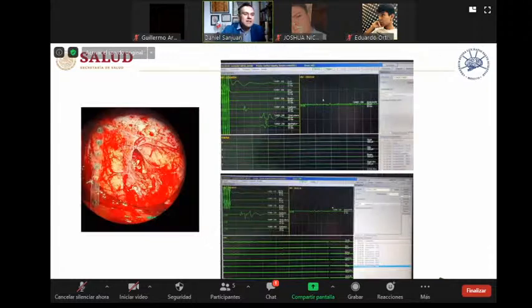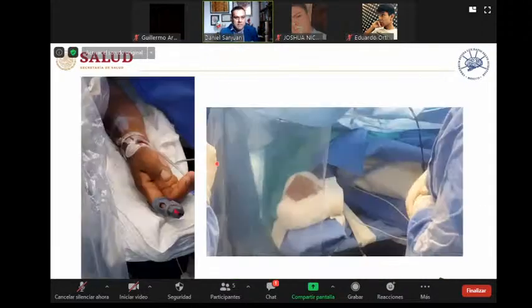So this is in the real world using the strip, and then we apply the stimulus, and you can see the responses in the anterior tibialis or in the toe of the patient or in the digiti minimi. And it's preserved. Using the other area, you can see the free EMG. This is the motor evoked potential and the resection of the tumor in an eloquent area. In this eloquent area, because it's so close to the resection, the strip.